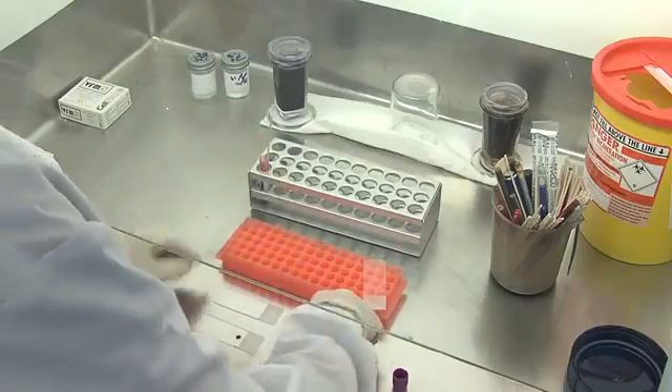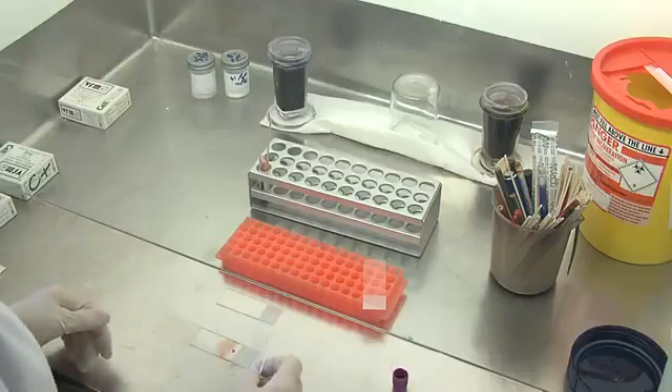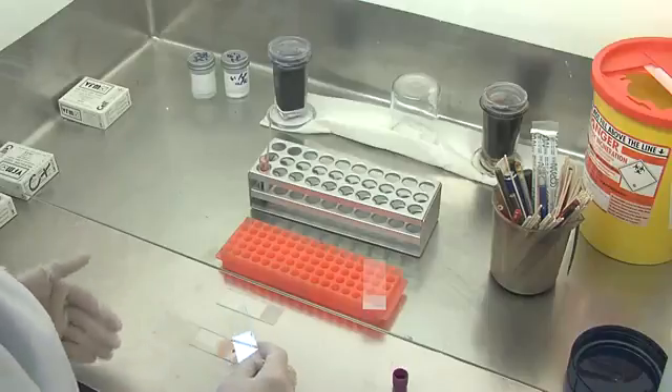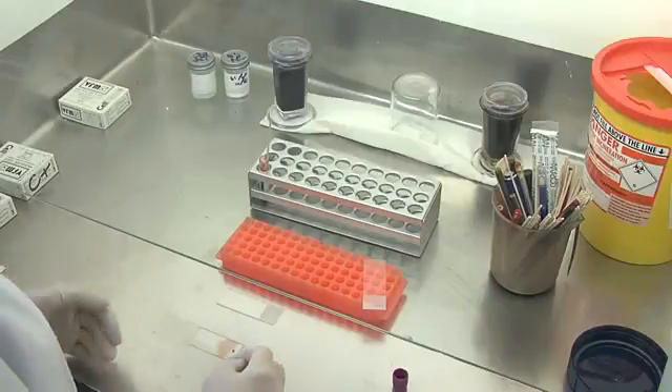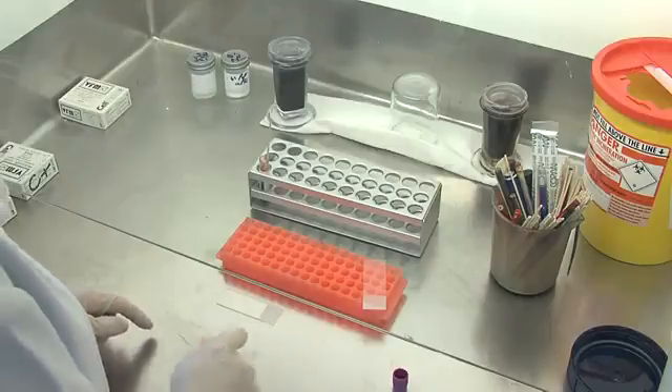Take a drop of blood and put it on the slide, and then we're going to make a thin film. The reason for using a thin film is because you get it one layer thick, and then it's easier to fix the film. You can then look at the parasites and the shape and size of the red cell.